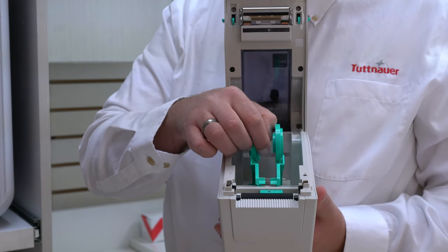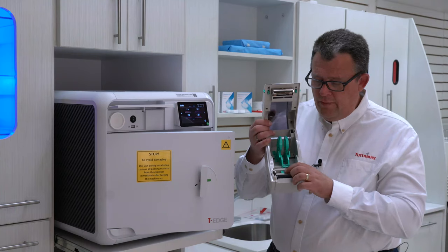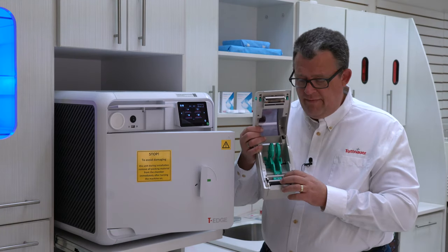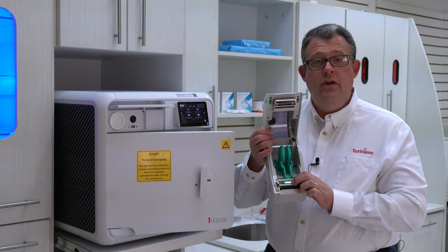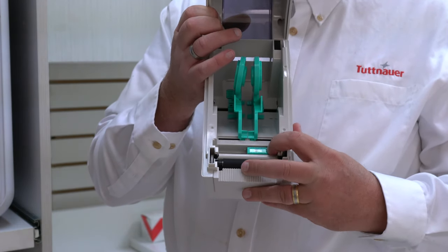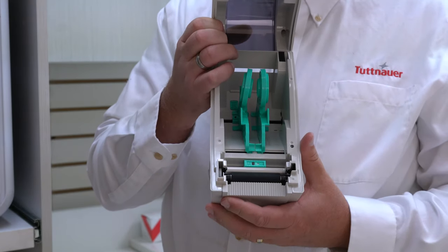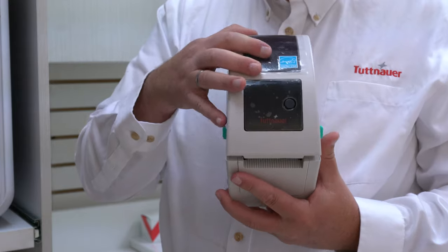Important to note that there's a little green button here, and that little green button is in the center when it's shipped out. If it's going to be a label, you're going to set this over to the right just one or two clicks. If it's going to be a printer for cycle history, you're going to push it over to the left one or two clicks.